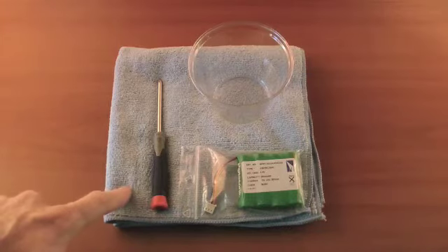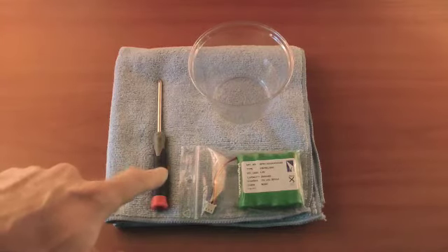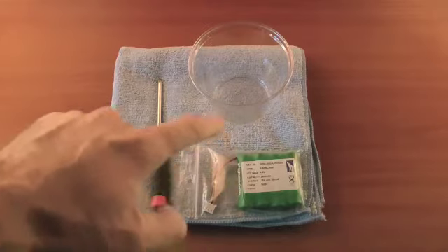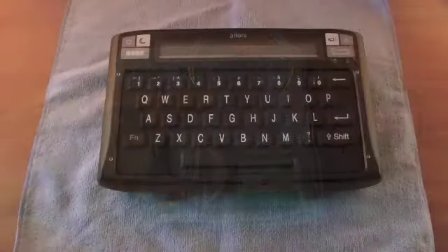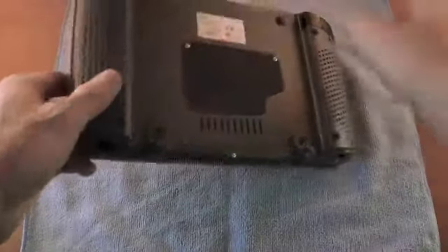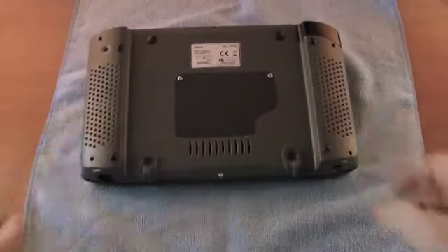You will need a clean cloth or towel, a small to medium-sized Phillips head screwdriver, a new Allura battery, and a container to hold the battery cover screws. Unplug and turn off the Allura, put it face down on a clean cloth on a flat surface.